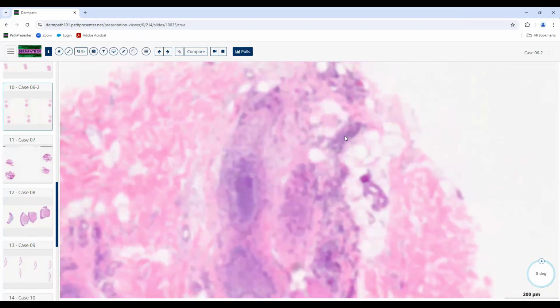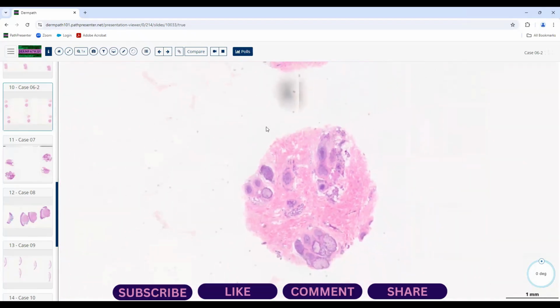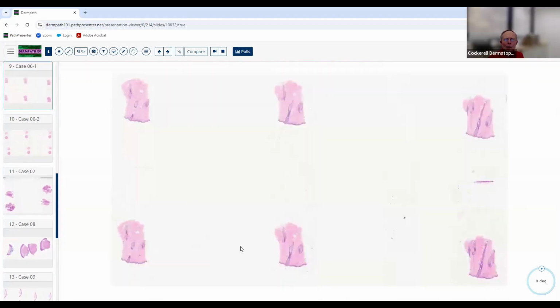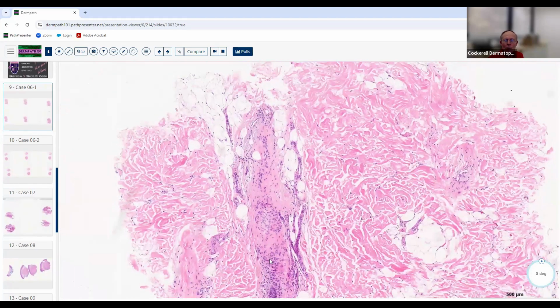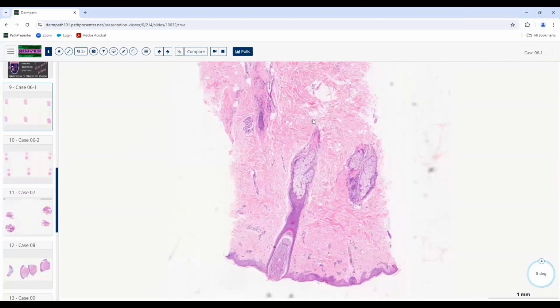They do have it. It's easier to appreciate on the previous slide, but they have a peribulbar infiltrate. Yeah, I apologize for that one. There's a little bit of peribulbar inflammation over here. There's not much even in this, but there's a tiny bit here, like you noticed. So what's the diagnosis? Alopecia areata.